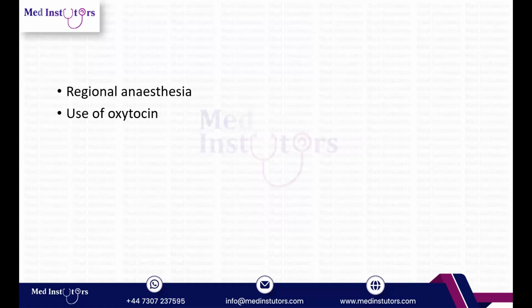Even if you're wrong, it's fine. Obstetric unit, correct. And before augmentation of labor, that is before giving oxytocin, would I offer her epidural? Yes or no? Correct. So these questions you'll have to remember, and these small points you have to remember because in extended matching questions, these matter. Okay.